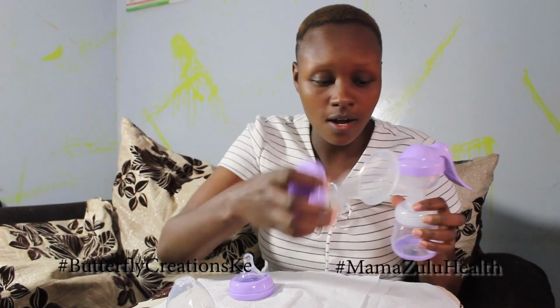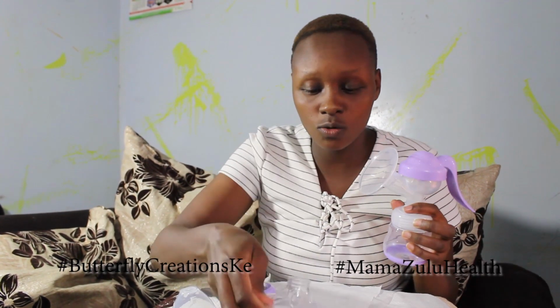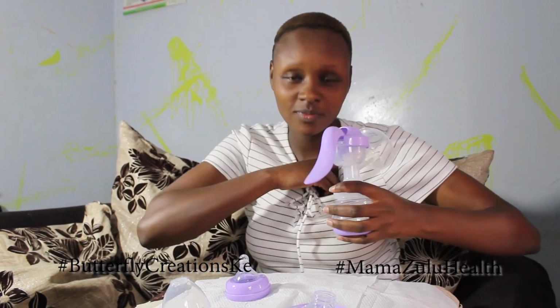Usually it inakwanga hapa ya kufunika like this, and then you press it when you're not using. But when you're using, of course it has to be open. So we go directly with the breast. Nikuonyeshe vile unatoa maziwa.